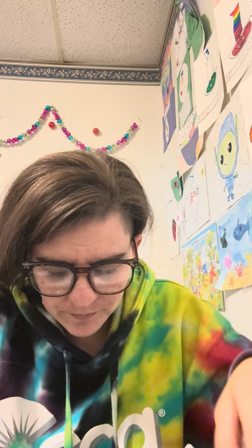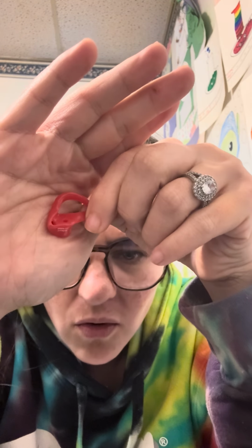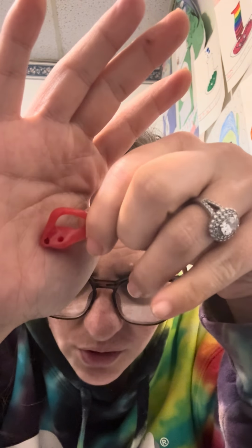Anyway, this is my tubing. So what you do is you take the portion that goes in your ear. You need to pay attention. There's 2 holes. Some people have no hole, like only 1 hole. But 2 holes, because the other hole is called a vent to allow airflow for certain frequencies. Anyways, I'm not going to explain because that's not what this video is about. So there's 2 holes. You need to know which hole your tubing goes in, because you're not going to put it in the vent hole. So my vent is the one closest to the edge, and my tube hole is the other one.